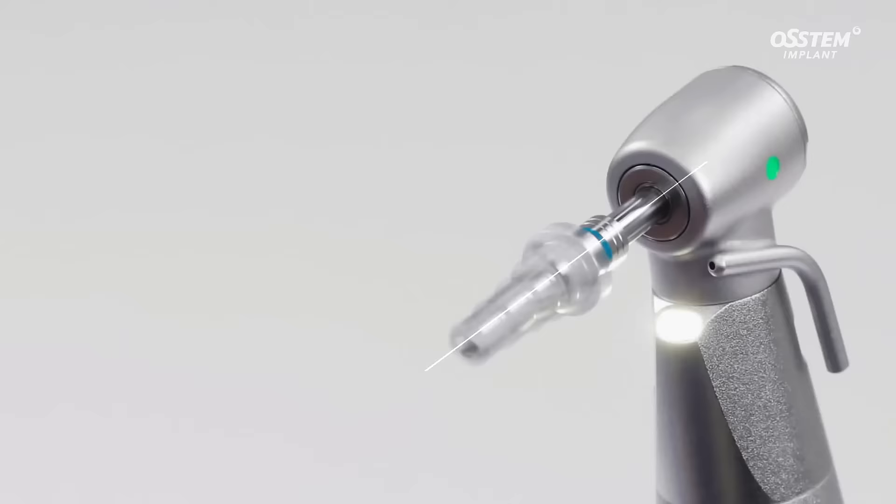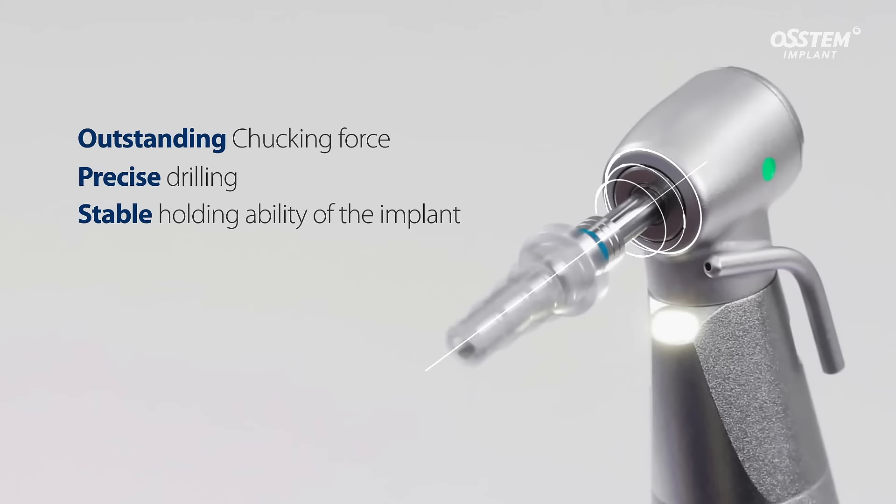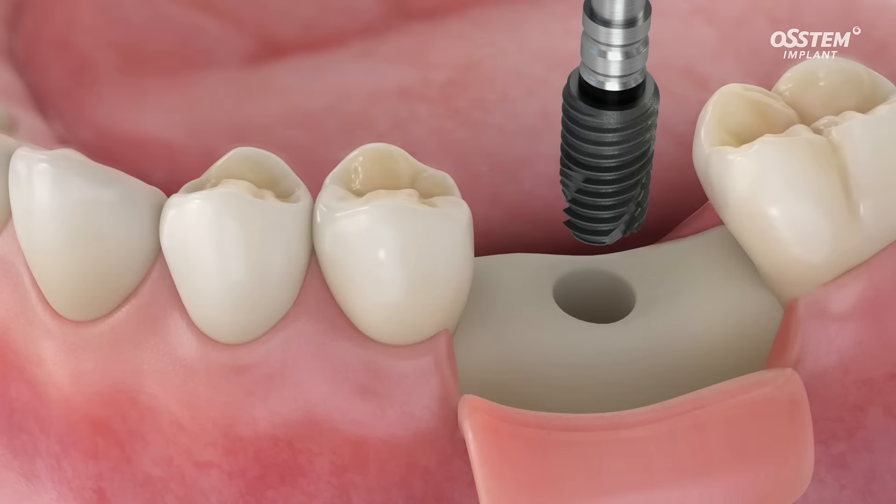First of all, SM5 provides accurate drilling results thanks to its outstanding chucking force. The implant can be safely placed since the implant is firmly fixed, minimizing unstable vibrations.